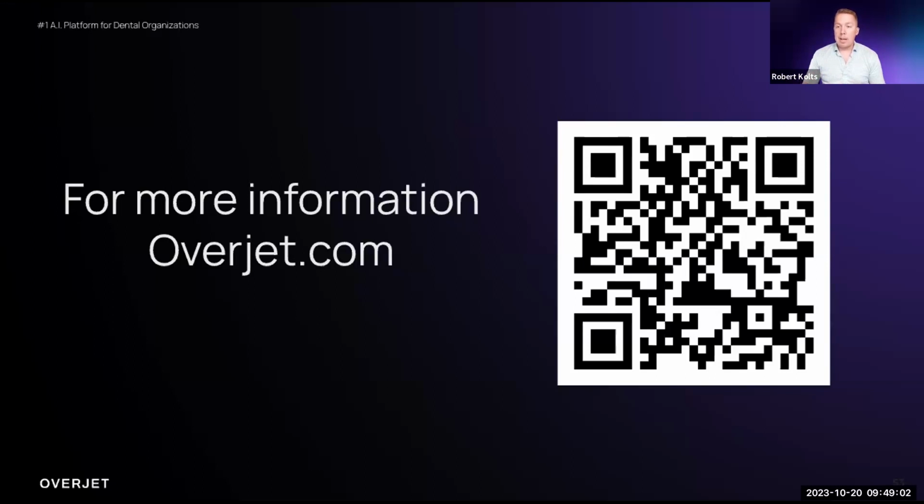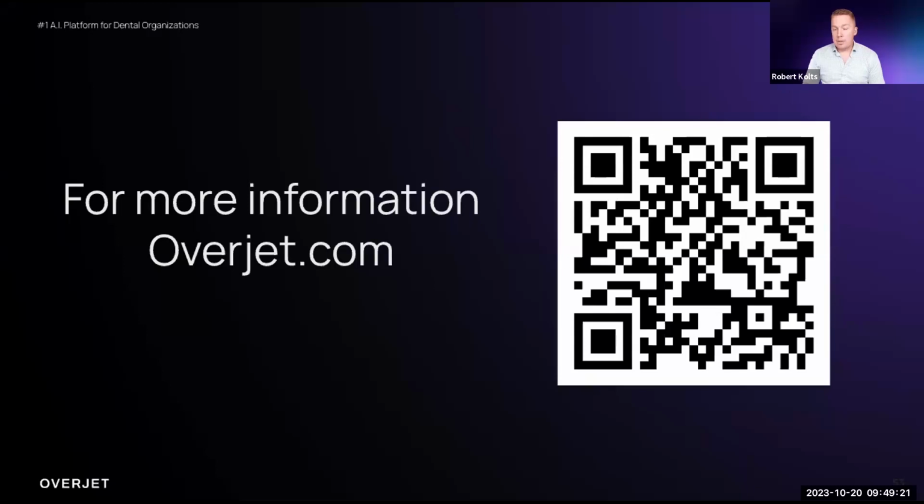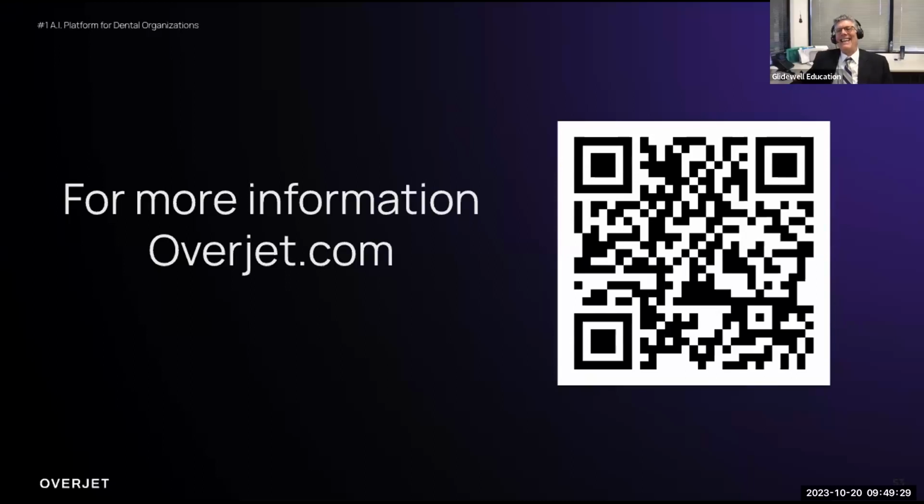I think really what you're getting at, though, is AI is going to highlight the need for quality X-rays rather than overcome the challenge of having poor quality X-rays. Right. I mean, just as AI helps to standardize the findings, well, we kind of have to standardize the diagnostic information that's going into it as well. So, yeah. Well, what's really interesting is a common feature request that I get from clinicians is, can you tell my hygienist for me that they need to retake an X-ray? I mean, that's a challenge.